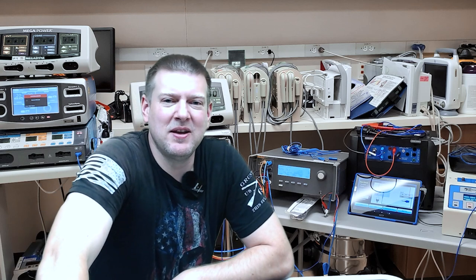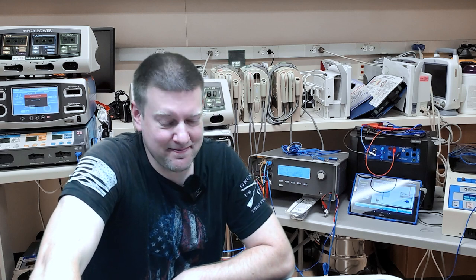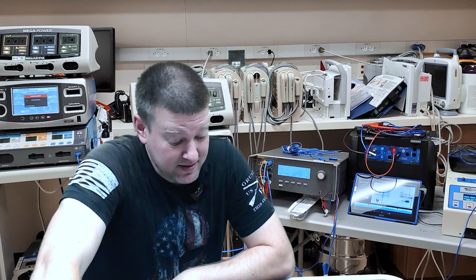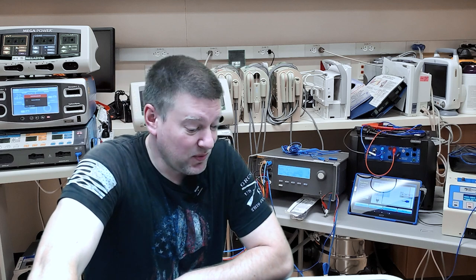You guys ever have one of those days when you get a piece of equipment and you don't really know what it does, and it probably doesn't even matter because you still got to fix it, right? Today's that day. Never seen this item before. Probably never will again. We're going to tear right into it, see what we can find.